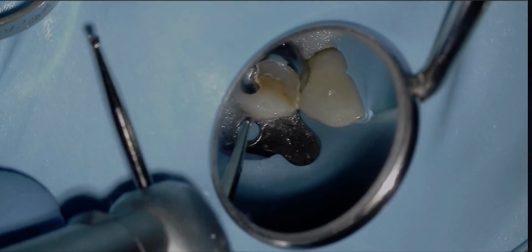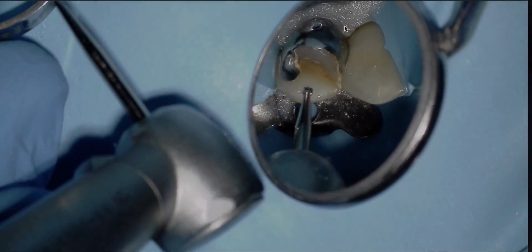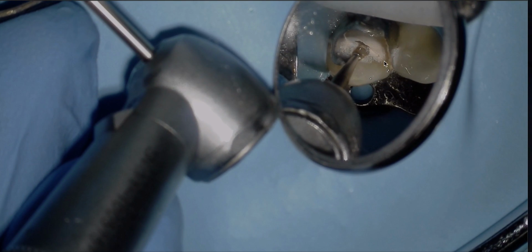So here we are. You can see there's the retainer for that Maryland bridge, and there's the bridge there, the pontic. I'm taking a number 2 long surgical round bur. Because there's no restorations to guide me, I'm making my access preparation between the 2 cusps, just a perfect line, back and forth, back and forth.